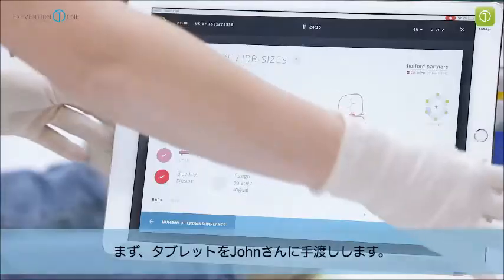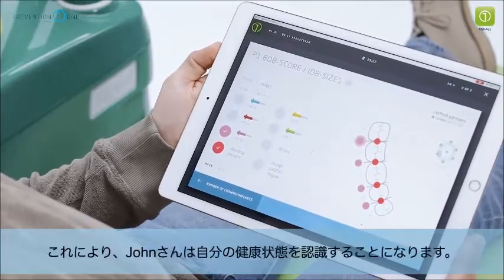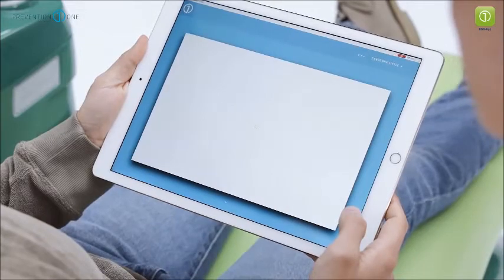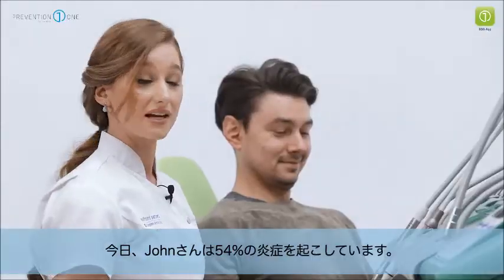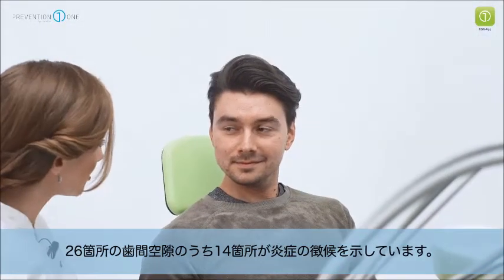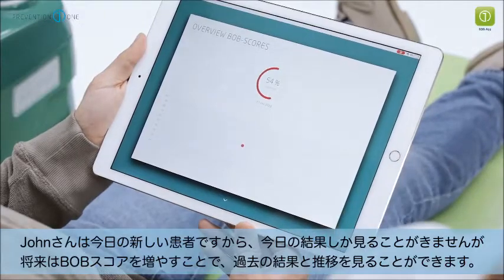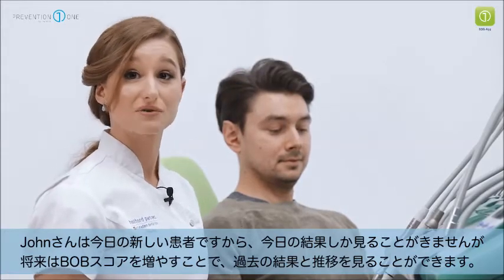Now it's time to complete the score by passing the tablet to John, so he completes his overall Bob score and takes ownership of his own health. So John, can you click the finish button for me please? Today John is 54% inflamed — 14 of his 26 interdental spaces have shown signs of inflammation. As John is a new patient today we can only view today's results, but in the future by doing more Bob scores I will be able to view his past results as well.